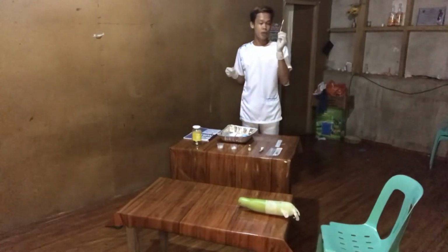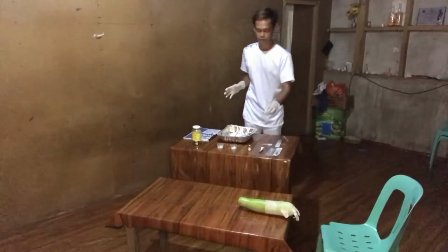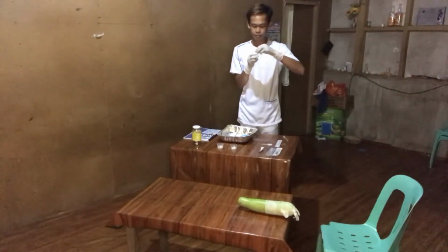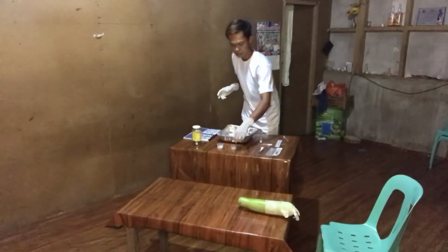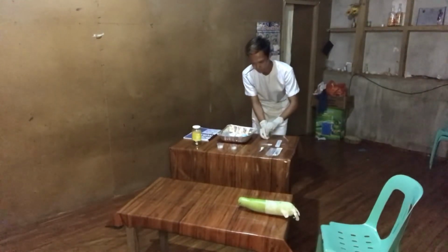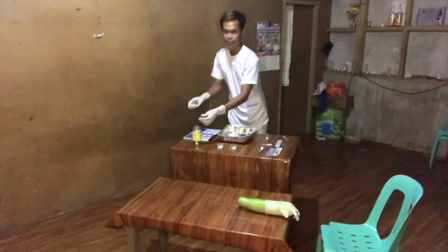I'm going to set aside the medication vial and open it. Before we open the medication vial, all we have to do is clean it with a cotton ball soaked with alcohol, and then dispose of this in the waste receptacle.